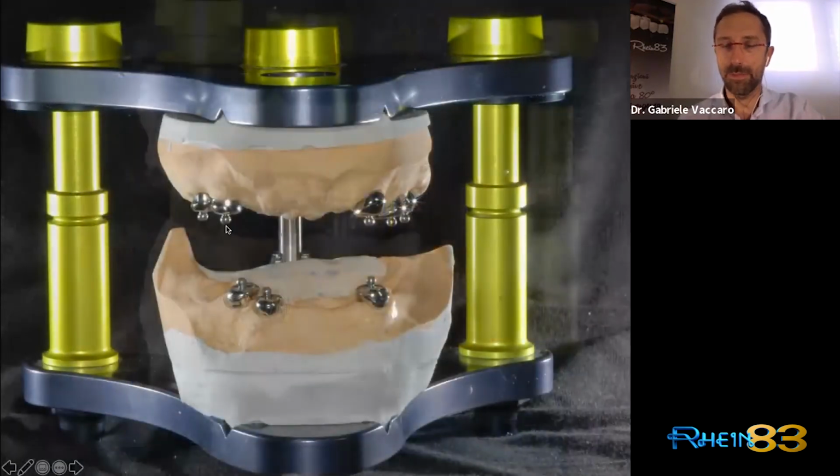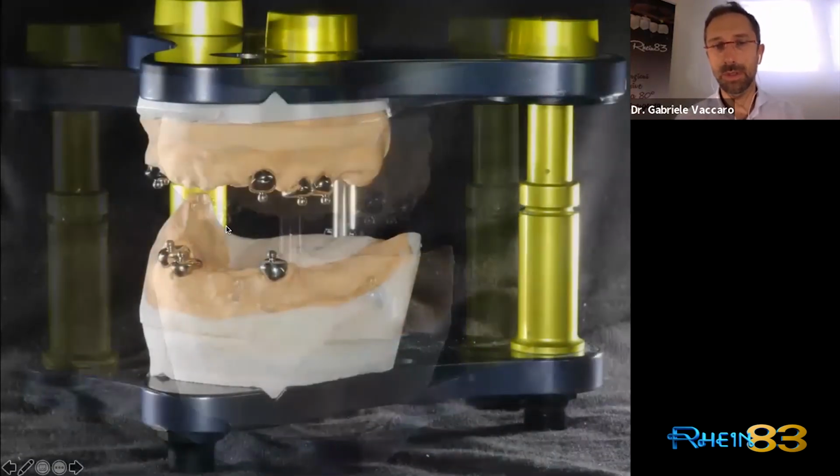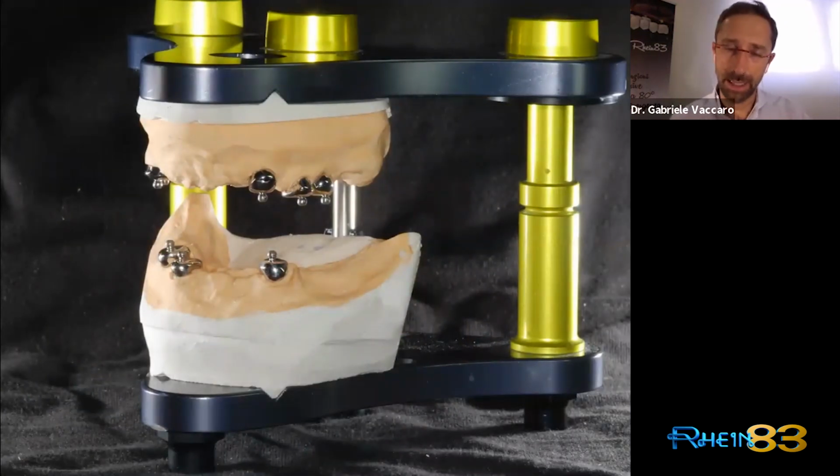With this system, it's possible to put the ball attachment wherever we want, because we don't need to follow the root axis as we have to do when we fix the direct pin. We can cut in two parts: the part that goes inside the root canal and the part with the ball attachment.